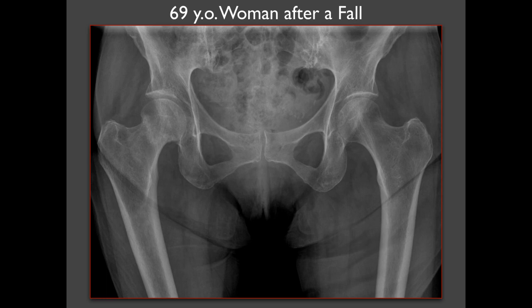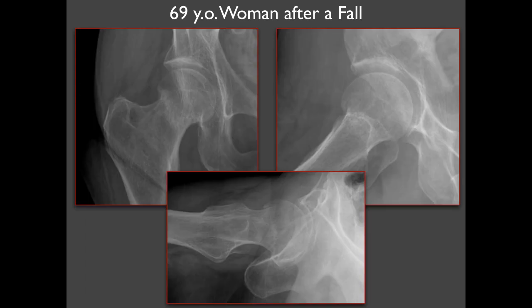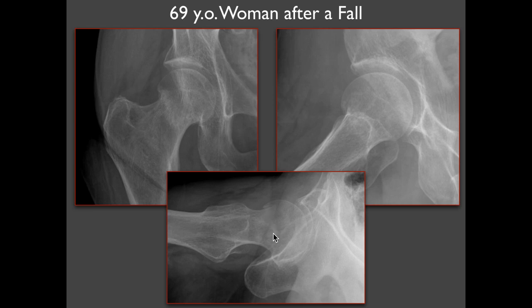Here's a 69-year-old woman after a fall. Take a look for an asymmetry that might be a fracture. Focusing on the right hip, you can see a band of sclerosis that's not present on the opposite side. Another feature to look for is discontinuity of the femoral neck. On the frog leg lateral view you can see the femoral neck and then an acute angulation where the fracture is. On the true lateral view there's a little offset of the femoral head with the neck — the fracture is coming across like so.